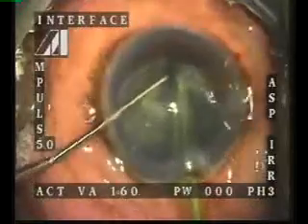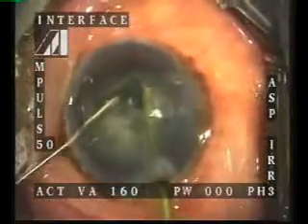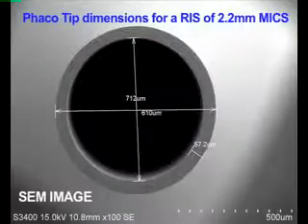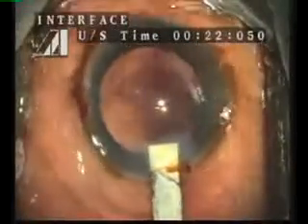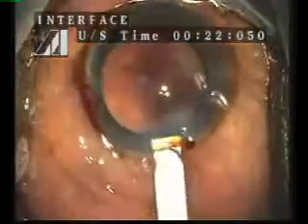In contrast, for a 2.2 mm microcoaxial phaco procedure, the vacuum level could be reduced to a certain extent considering the slightly larger bore size of the inner lumen of the needle being used for the procedure. Active and passive incision sizes were measured even after the aspiration of the cortex with the microcoaxial IA needle tips. A mild stretching of 0.1 mm of the internal lip size is observed.